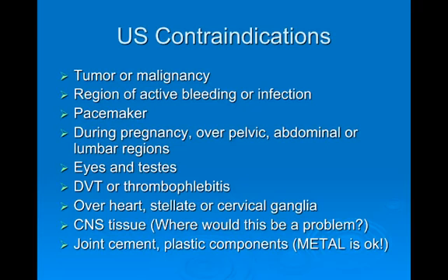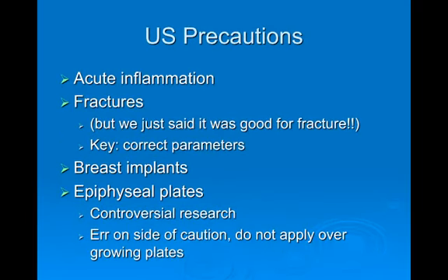Well, that wasn't in a live subject, okay? And not with a clinical stimulator as well. So while ultrasound could affect these things, very, very doubtful you're going to affect them at a deep level. But just something to keep in mind as you go through. So it's listed as a contraindication because obviously if something comes loose and you've done ultrasound over it, you're the one that's going to get the blame for it. So err on the side of caution when it comes to over any kind of joint cement or plastic components.